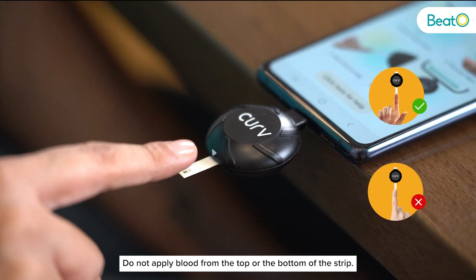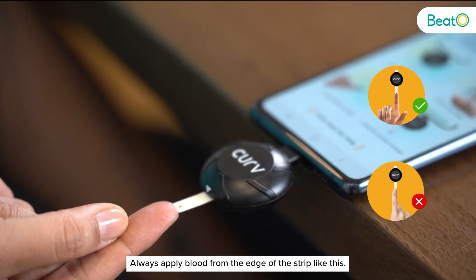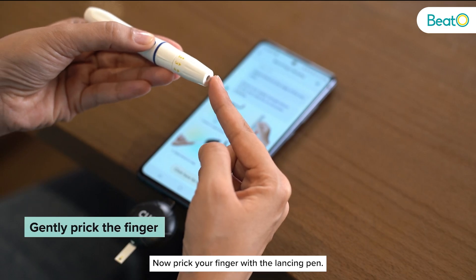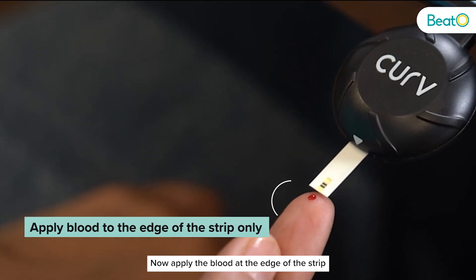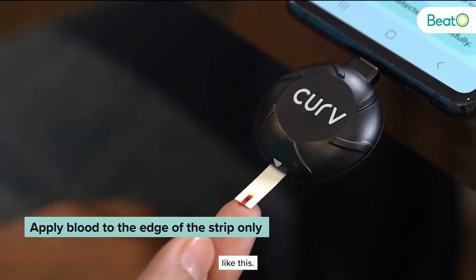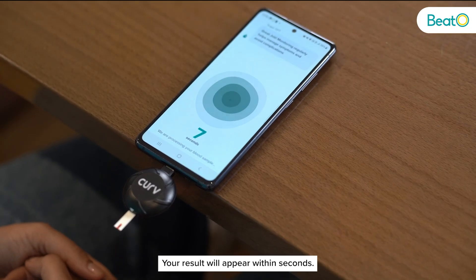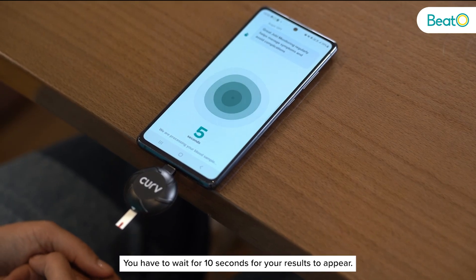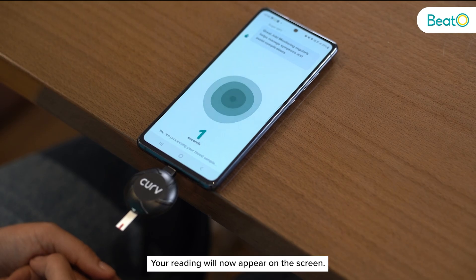Do not apply blood from the top or the bottom of the strip — always apply blood from the edge of the strip. Now prick your finger with the lancing pen and apply the blood at the edge of the strip. Your result will appear within seconds; you have to wait for 10 seconds for your results to appear on the screen.